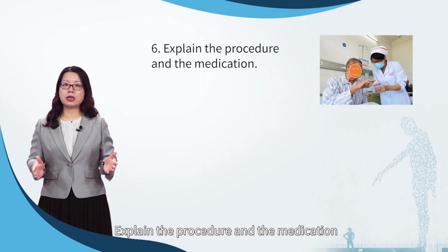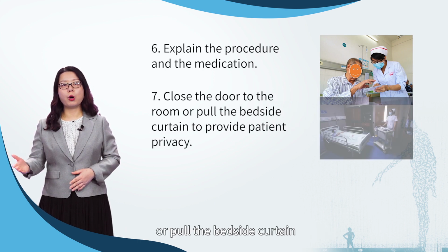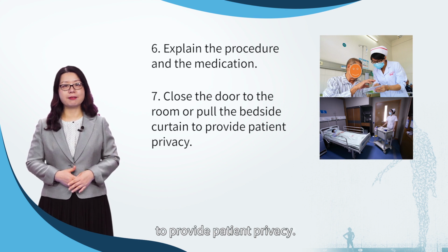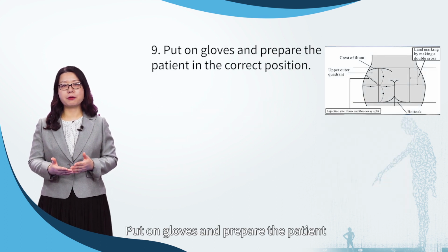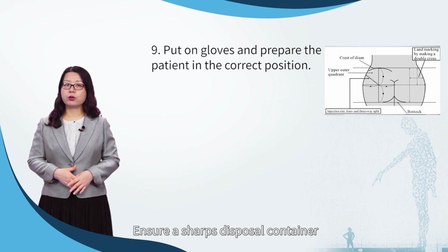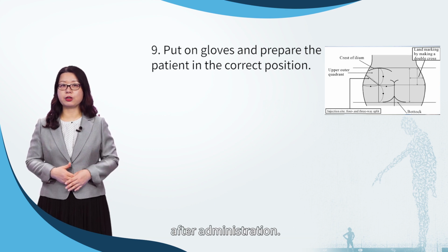Explain the procedure and the medication. Close the door to the room or pull the bedside curtain to provide patient privacy. Perform hand hygiene again. Put on gloves and prepare the patient in the correct position. Ensure a sharps disposal container is close by for disposal of the needle after administration.